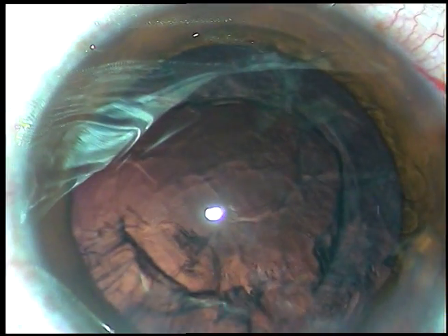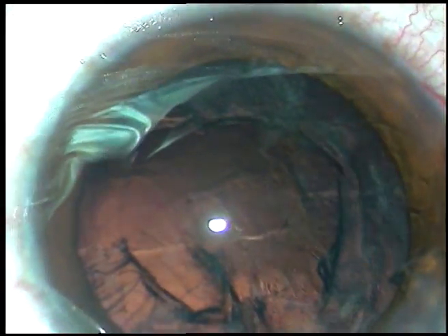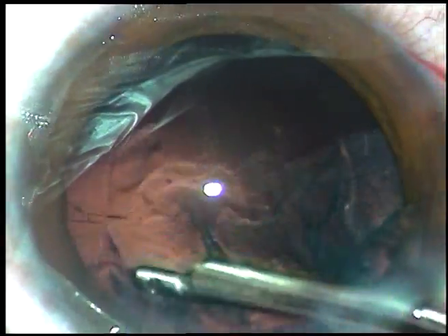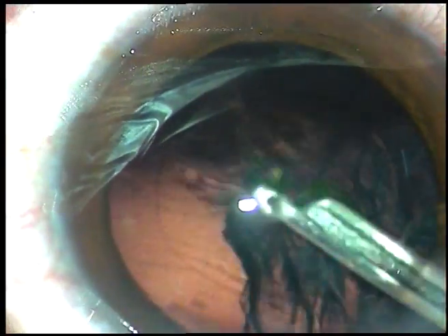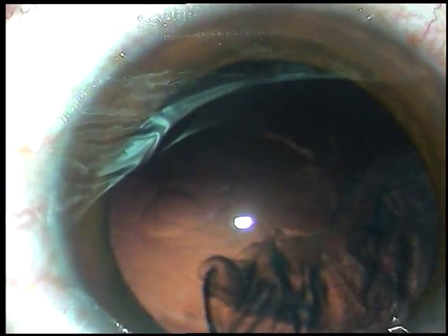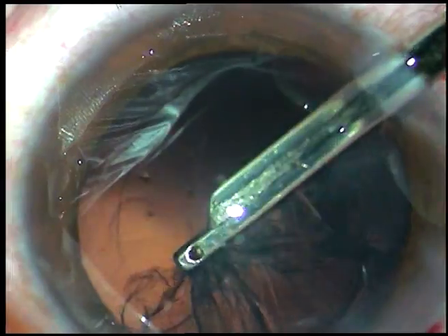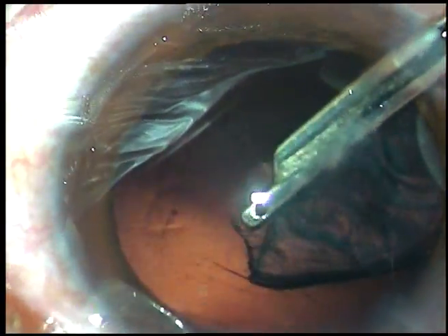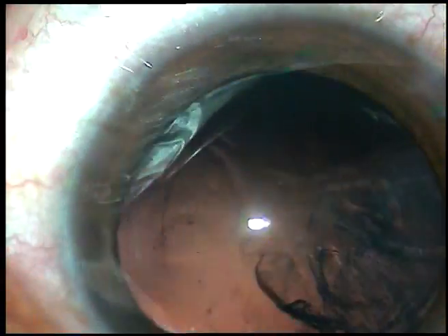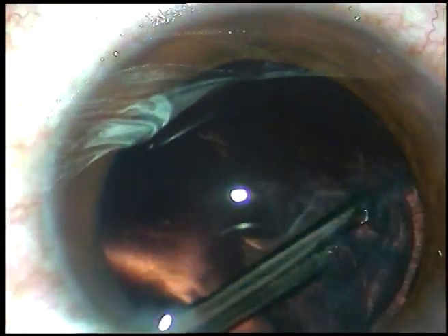Now, viscoelastic substance is injected, and in this case I am going to use a 23-gauge Simcoe cannula to remove the cortical matter. I encourage you to use bimanual irrigation-aspiration because with the Simcoe cannula you have to make the side port a little larger, whereas with bimanual irrigation-aspiration you can make smaller side ports.